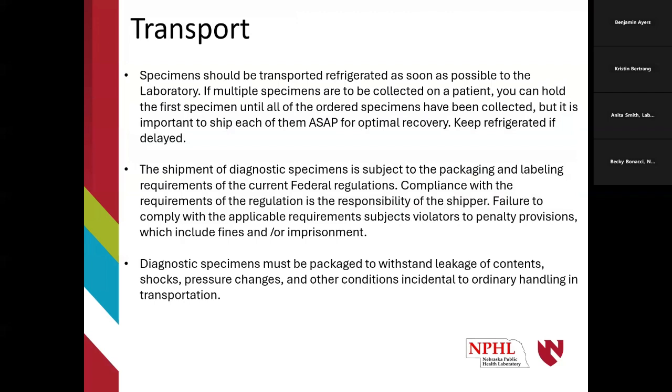Since we do function as the public health lab for the state of Nebraska, many times we get follow-up cultures. For follow-up cultures, it's always best to send one and make sure that the smear is actually positive. If it is, there's no need to send the second and third times three.